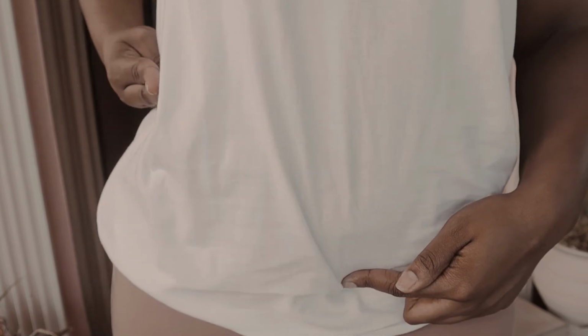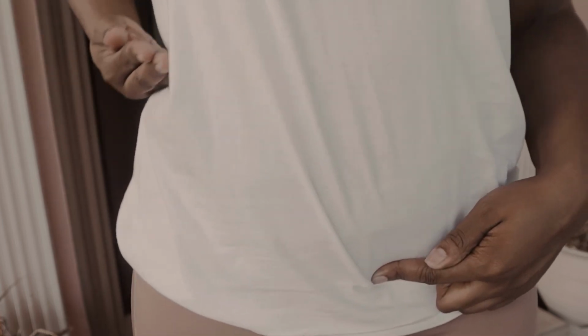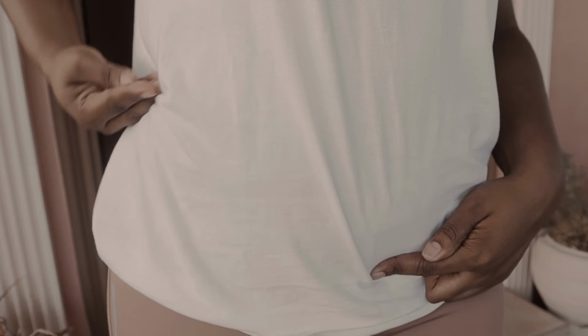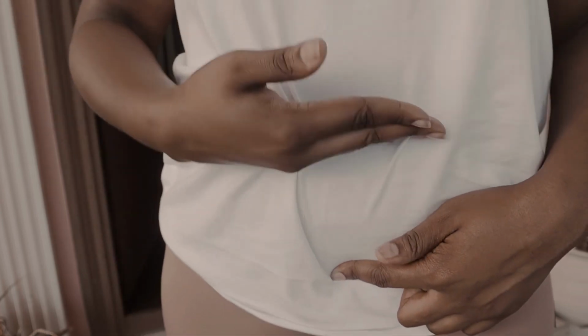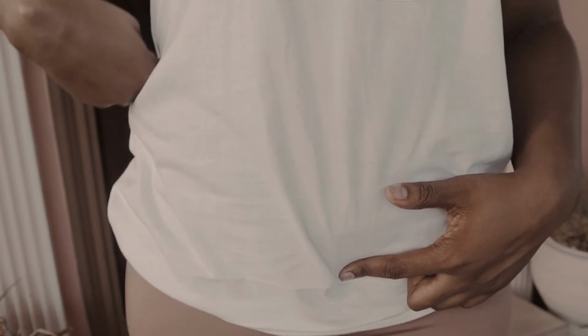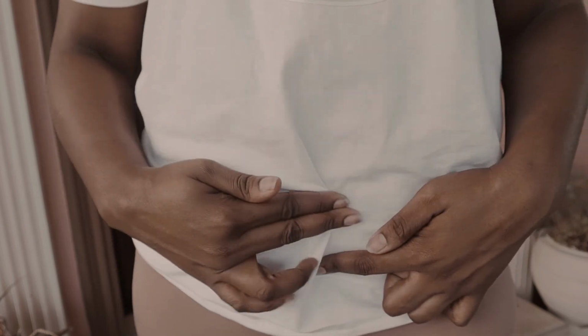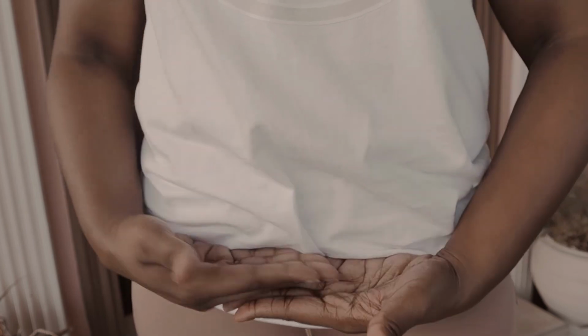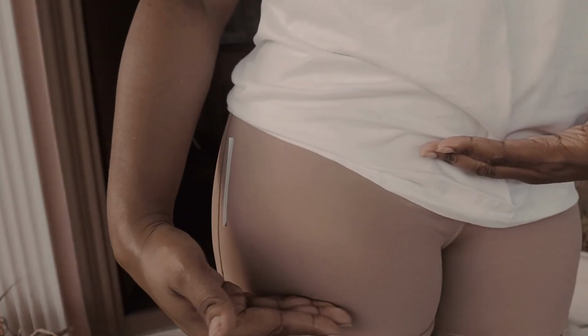Please do it. This is my lower costal margin here, and right below that, because I have a short abdomen compared to the, well, I have a short torso in general, right? So there's my lower costal margin. And right below that, not even an inch or just about an inch, I could feel for my crest. So yeah, once you have the lower costal margin on, your crest is there, right? ASIS, work my way around, symph, center point right here. So it'll be about that till about right there past the symph.